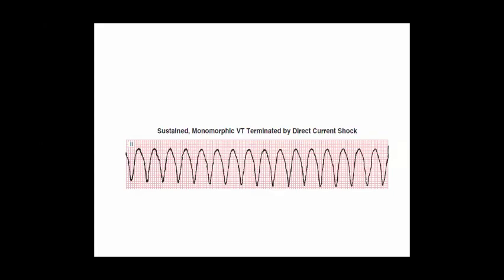Now, this is the standard pattern of ventricular tachycardia, and although we didn't talk about ventricular tachycardia today in the EP lab, this is a very important clinical entity, either to occur in the patients in the CCU or even during your studies. Sometimes the patient goes into VTach. Of course, many of you who used to work in coronary labs, this is very familiar to you. And this is monomorphic ventricular tachycardia.